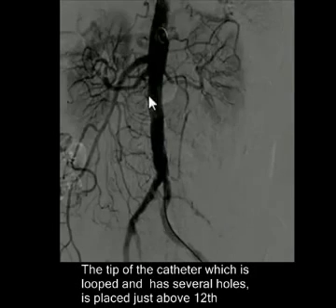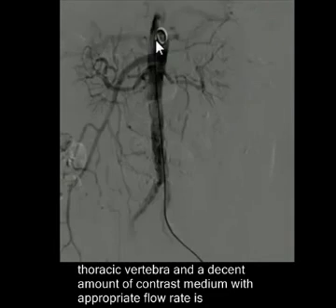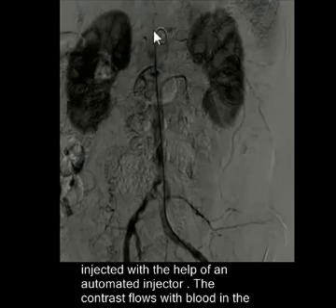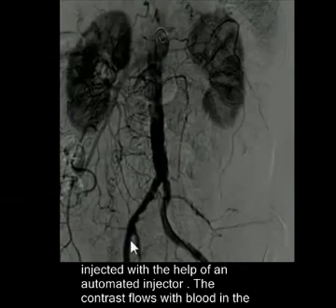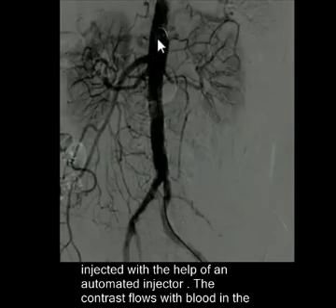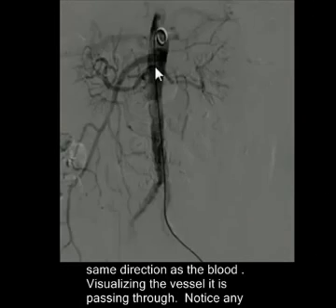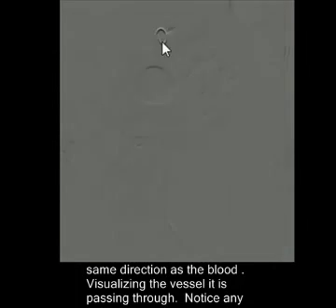The contrast medium is injected. A decent amount of contrast medium is injected with the help of an automated injector with a decent flow rate, and the contrast flows with blood in the same direction as blood is flowing, and as a result the blood vessels become opacified, become visible clearly.